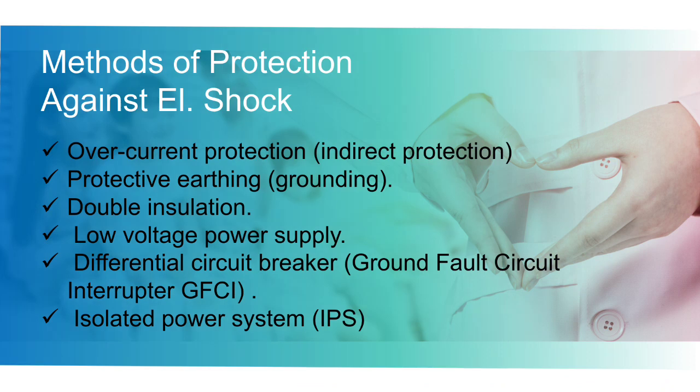So these are the methods to be followed to get protected against the electrical shock. Firstly, overcurrent protection, and next is protective grounding, double insulation, low voltage power supply, differential circuit breaker, and isolated power system. Let's look deep into these specified topics.